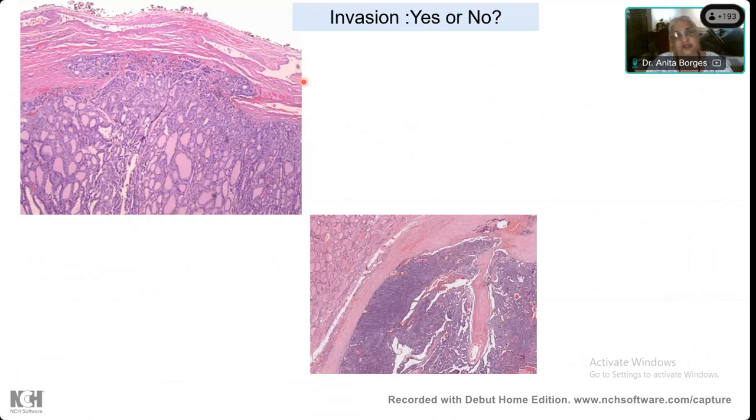It is going outside from the tumor capsule. So it has breached. You can see here a narrow neck and a mushroom shape. Okay, so it has gone through its capsule. So yes, in my book, this is an invasion of the capsule.